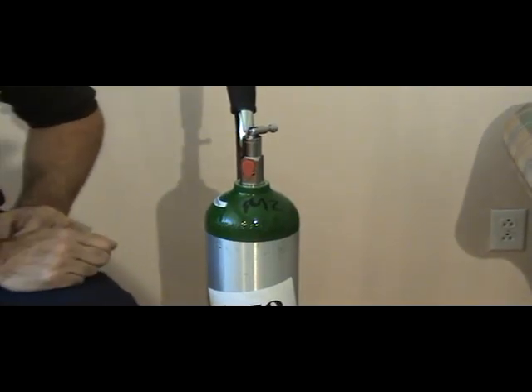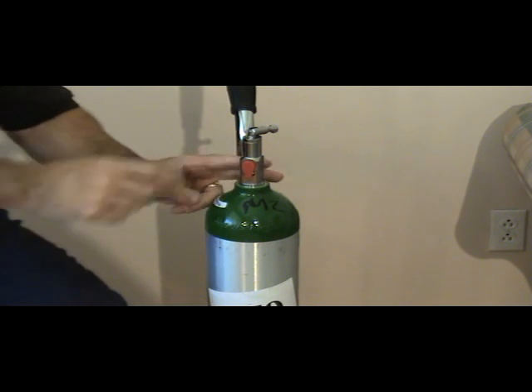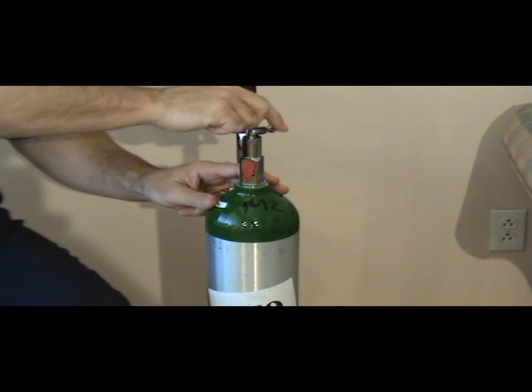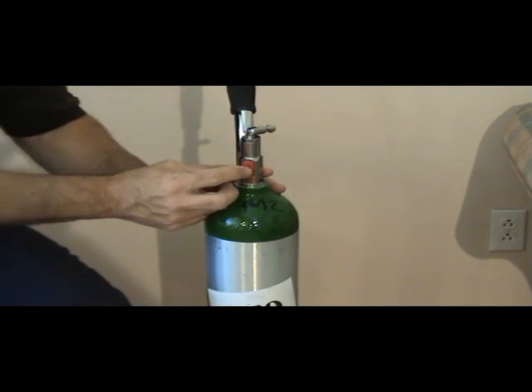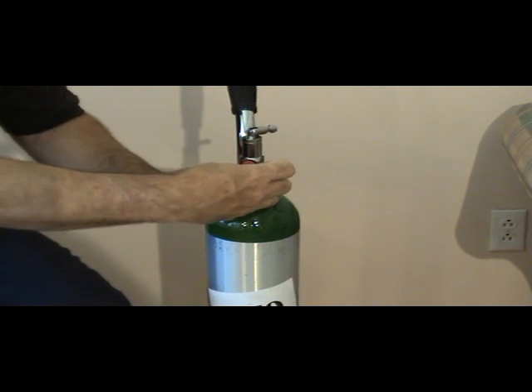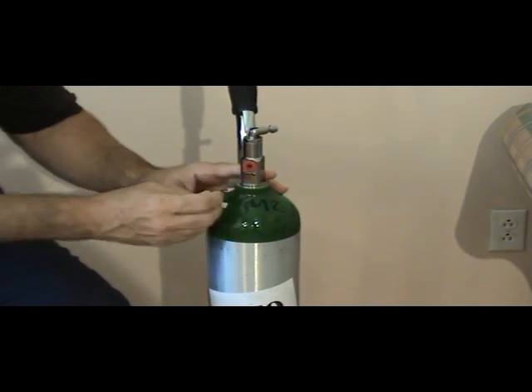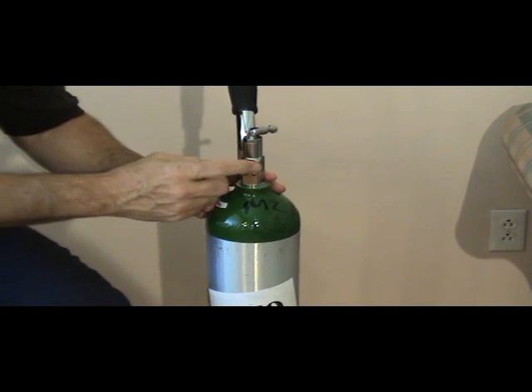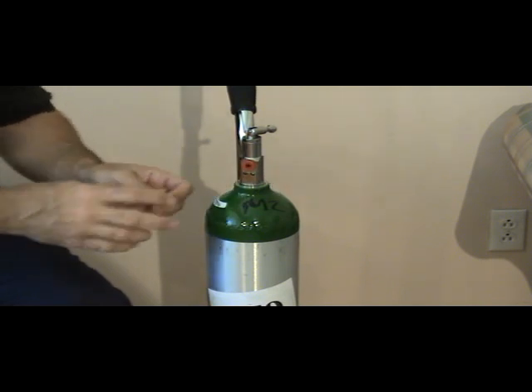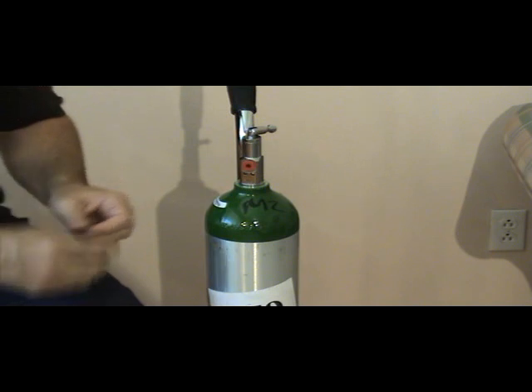This is our backup unit. I'm going to show you how to connect the regulator to the bottle and how to turn it on so that the oxygen flows. This bottle on top, again, what you have is a toggle. This is the unit that you will turn to allow the oxygen to come out. On the front here you have a little red piece. This needs to be taken off first. When you take this flat piece off, you'll see that there is another round red piece with a hole in it. That should remain there. It will seal the unit and not allow the oxygen to escape to the side.